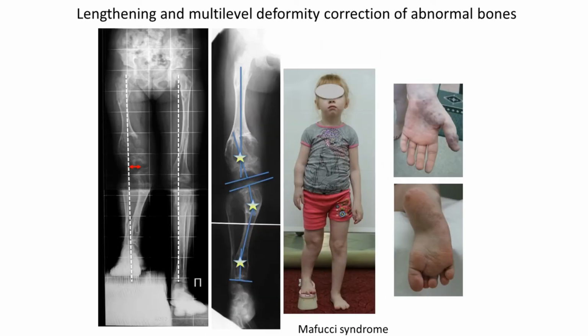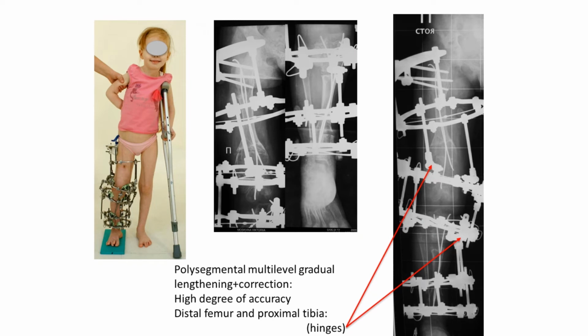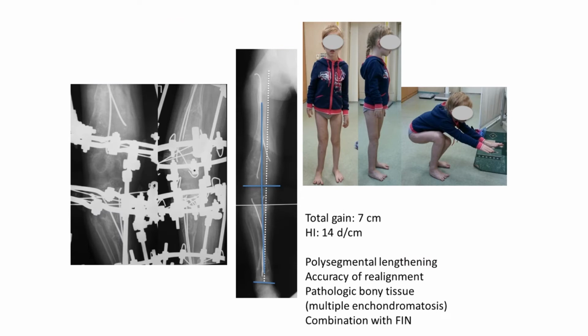As you can see in this case, a girl with Maffucci syndrome represents multi-apical deformity of the right lower limb with limb length discrepancy. We performed simultaneous polysegmental lengthening using intramedullary nailing and the Ilizarov technique. Finally, we achieved planned lengthening with accurate alignment of the lower limb, and the total gain was 7 centimeters with a healing index of only 14 days per centimeter.